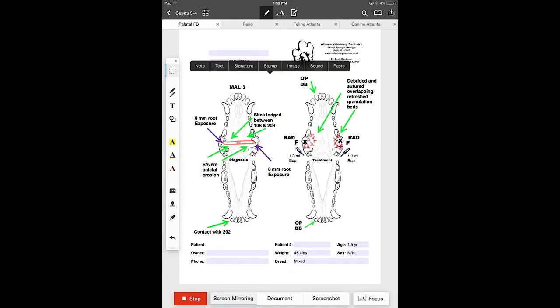Another function that we can perform with the hidden annotations bar is the addition of a little sound icon onto the dental chart itself. So when the client or the referring vet receive the chart they can click on that little sound icon and they can hear a voice message that you've left them associated with the chart itself.